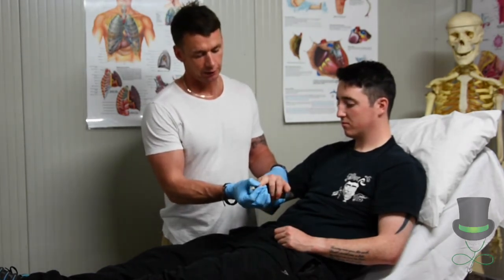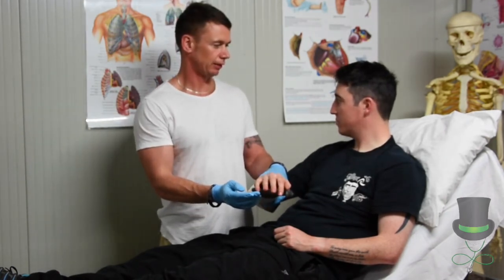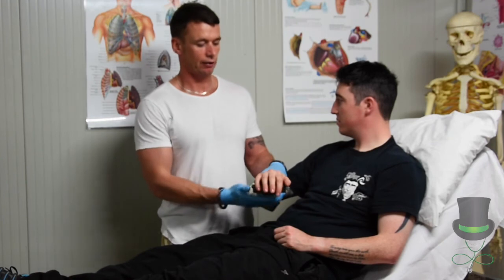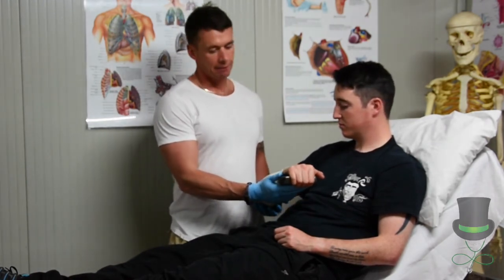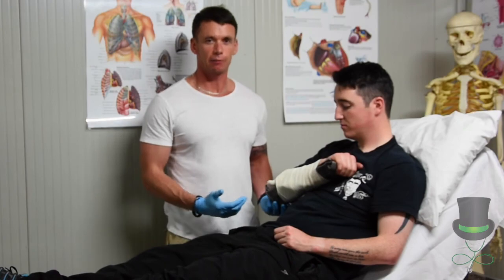Circulatory function — you look away from me, tell me what I'm doing. Excellent. Sensory function and motor function — can you move your fingers? Good stuff. We will then get a sling and keep this compact to the patient to add additional support.